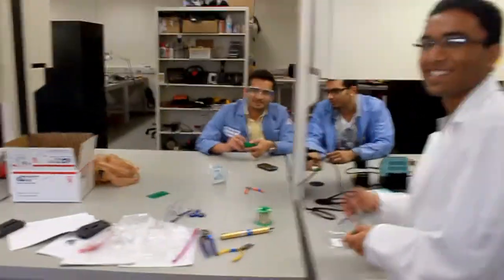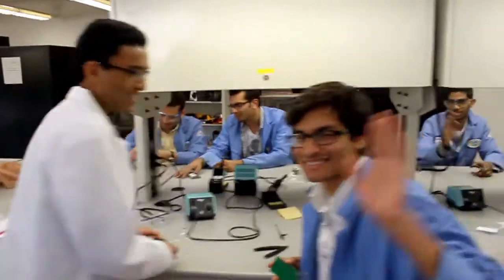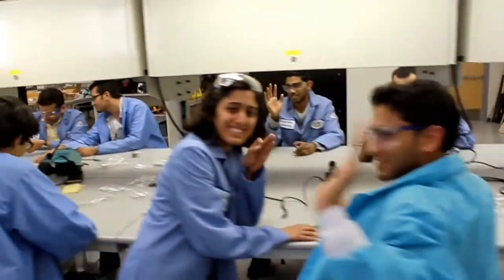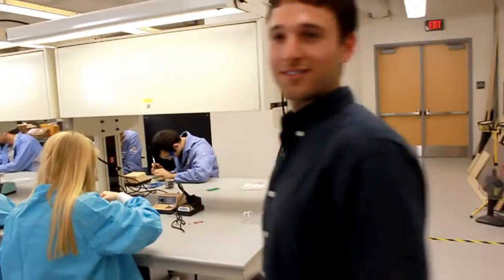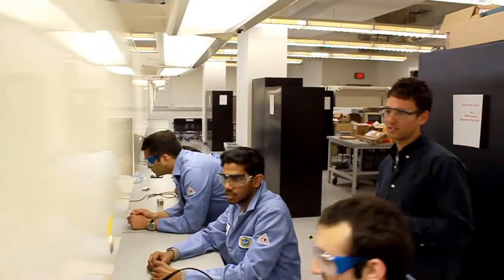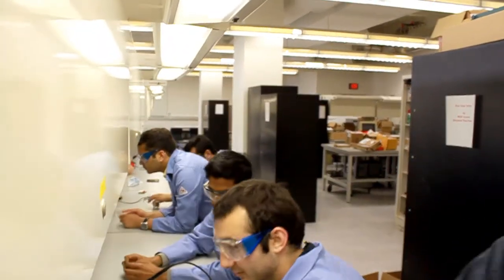These electrosurgery units are used to cauterize and cut skin. Basically, a lot of this equipment, when it arrives on scene, it doesn't really function well. So what we're doing over here is we're building a unit which can test these electrosurgery units. By doing so, these third world countries know if their ESU is working.